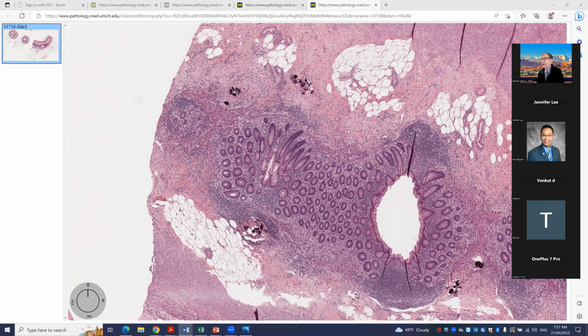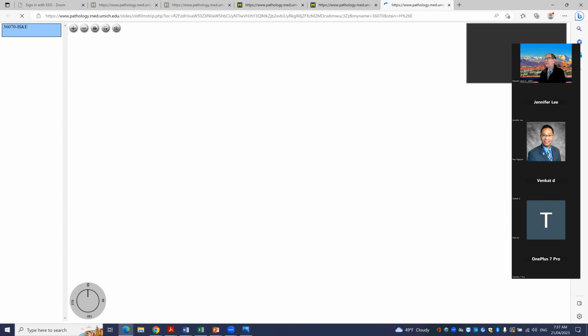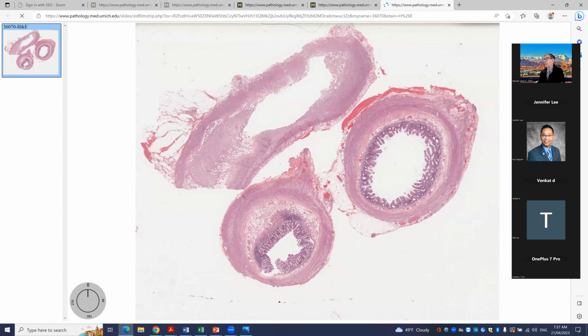This and other parasites very similarly oftentimes inhabit the body for lengthy periods of time without evident response. Okay, maybe eosinophils and so forth. So we'll move on to a different scenario here.